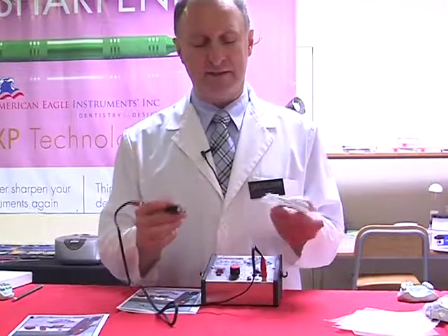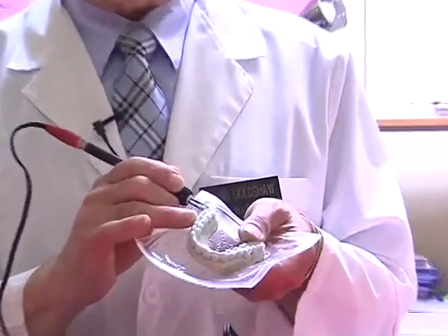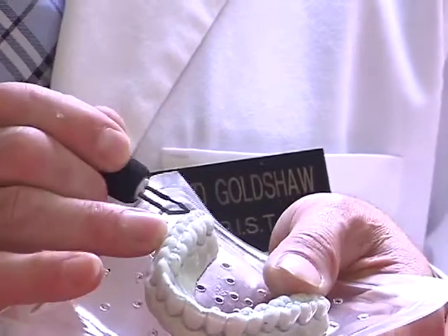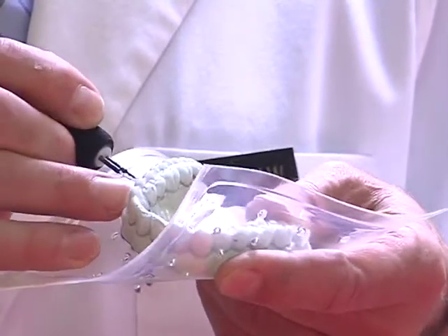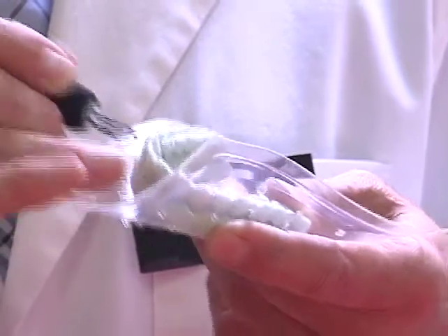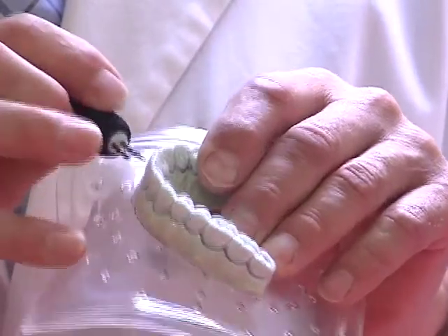and I'm going to start trimming. I normally start posteriorly and work all the way around. As I start, I'm going to use a scalloping motion. This is the style of movement that I'll use, and I'll trim all the way down to the surface of the stone, with a light pressure, allowing the heat of the tip to penetrate through our thermoforming material as I scallop my way around.